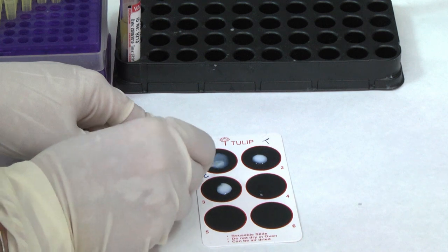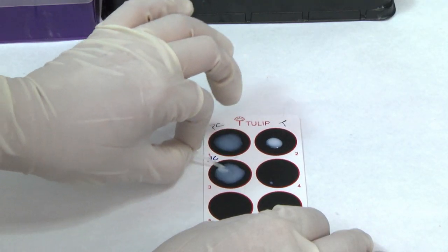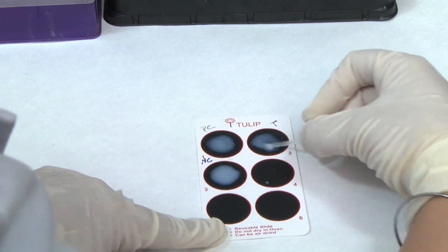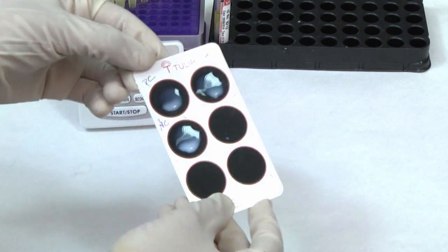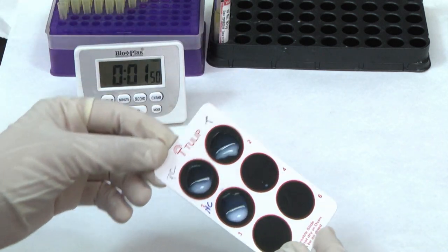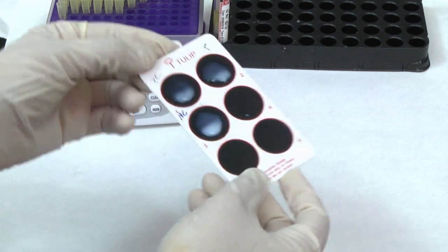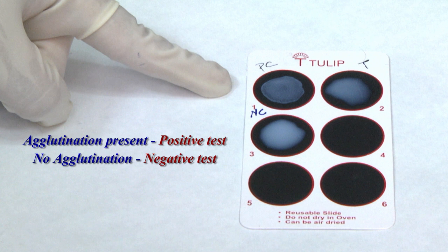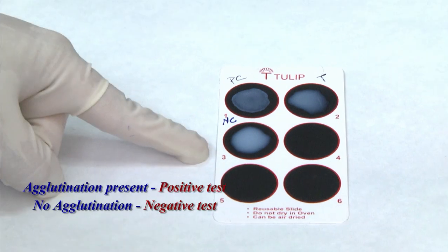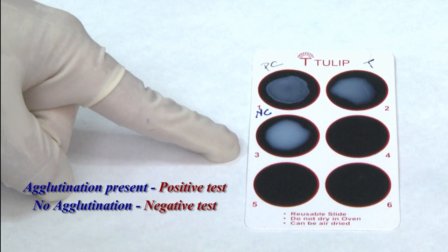Using a mixing stick, mix the test specimen and latex reagent uniformly over the entire circle. Immediately start a stopwatch. Rock the slide gently back and forth, observing for agglutination macroscopically at 2 minutes. Interpretation of results: agglutination is a positive test result and indicates presence of detectable levels of CRP in the test specimen. No agglutination is a negative test result and indicates absence of detectable levels of CRP in the test specimen.